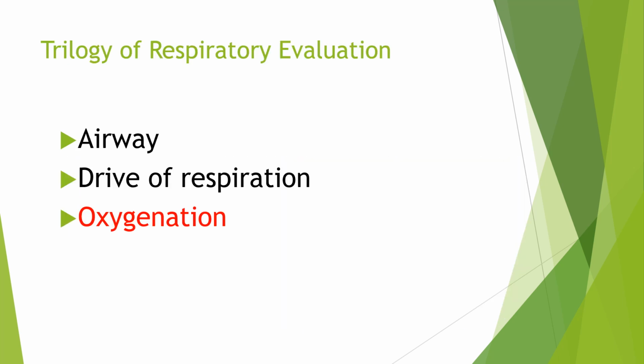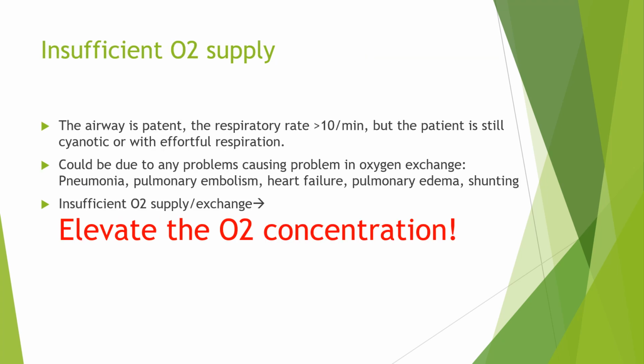And lastly, if the airway is confirmed patent, the drive of respiration is corrected, and you use the BVM, but the patient is still in respiratory distress, then we should consider administering oxygen to elevate the concentration of oxygen inhaled. So, the steps one by one.